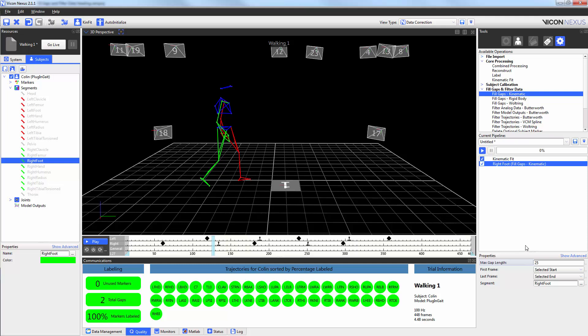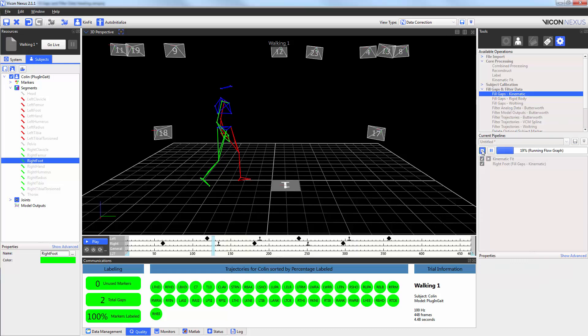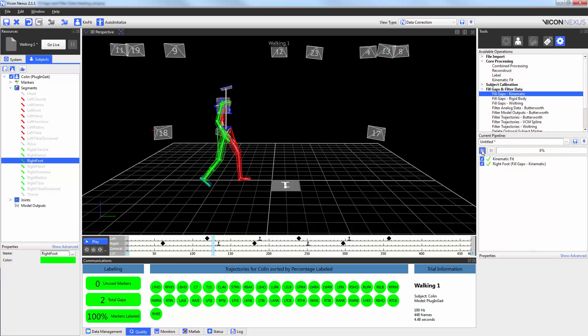Now, when I hit play, it's going to run the kinematic fit and then it's going to run the fill gaps kinematic fill. As you can see, the gaps in those markers have now disappeared.